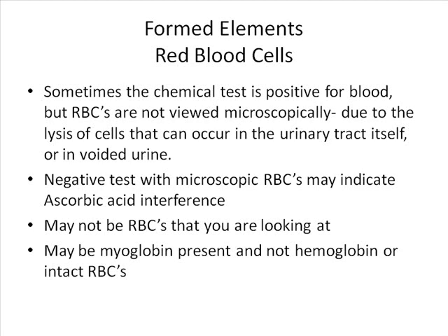If you have a patient, for instance, that was electrocuted, electrocution gives you myoglobin in the blood, which is filtered out in the urine, and you'll start to see it in the urine. I had a physician one time that said, I want to send this urine off for myoglobin, and I said, well, the blood is negative, so the myoglobin is negative. He didn't realize that it tested for both.